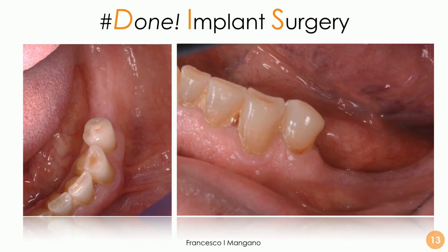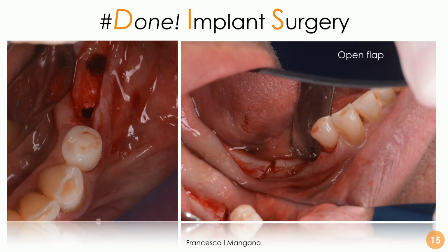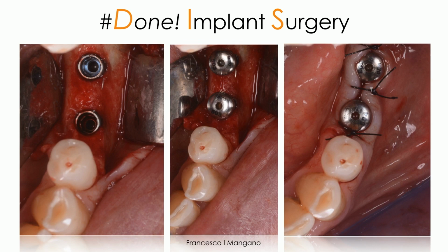And this is the preoperative picture of the patient. We of course go through a guided procedure with an open flap, and this is the preparation of the implant site by means of the guide, and these are the implants placed exactly as requested by the project. We prefer in this case not to place the implant through the guide, but manually, in order to keep the sensation of the bone quality.